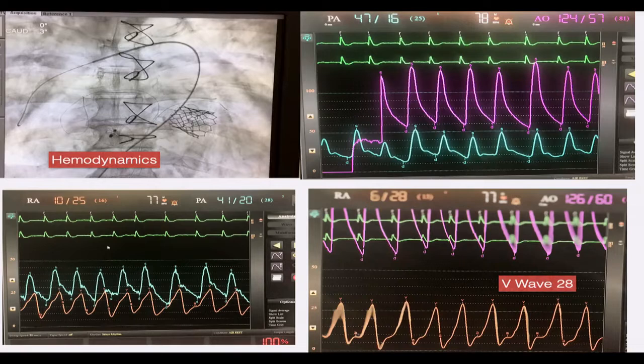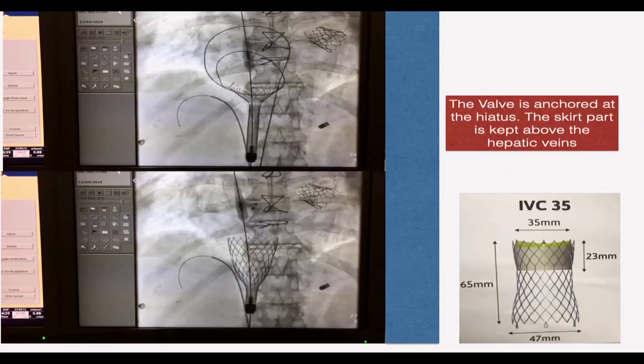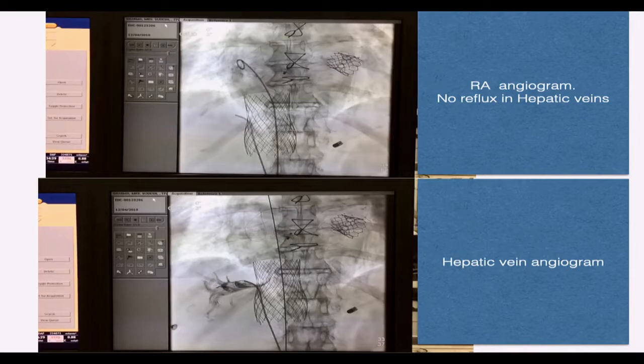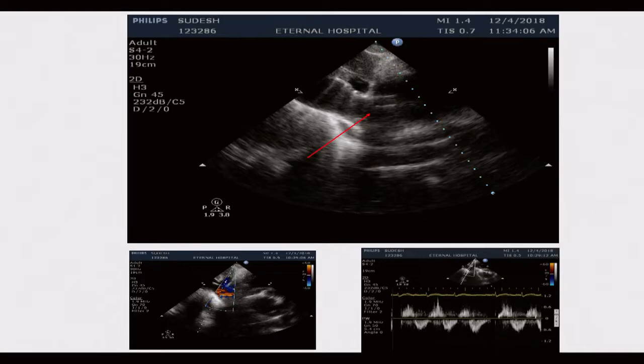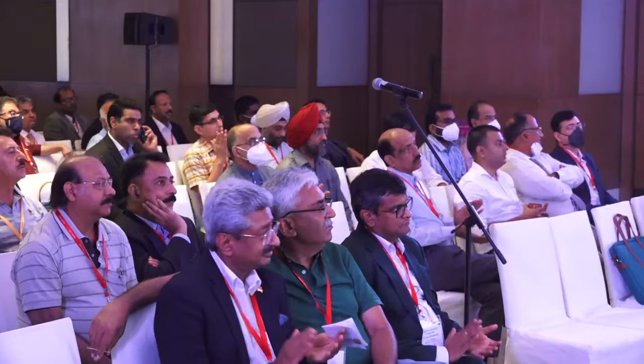The patient also had tricuspid regurgitation. We did not have a TriClip or other tricuspid therapies available; the only therapy available in India was the TRICVALVE. A wire in the right pulmonary artery acts as a landmark for the SVC-RA junction. We implanted a TRICVALVE — one component in the SVC and one in the IVC. A catheter in the hepatic vein confirms the IVC valve position and that hepatic vein flow is not obstructed. We placed the IVC valve first, then staged the SVC valve later to understand how these caval valves behave.